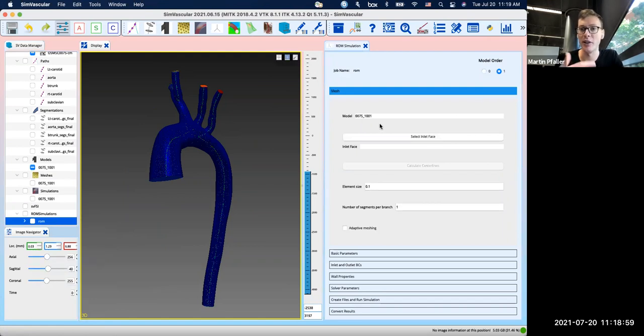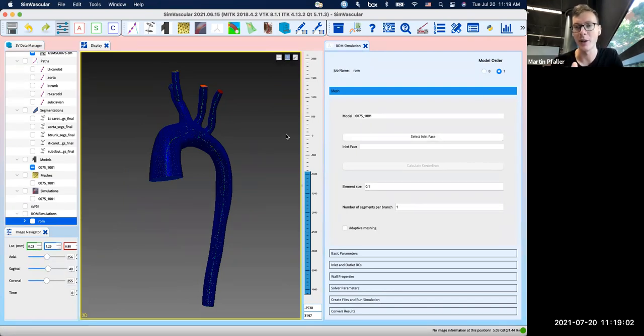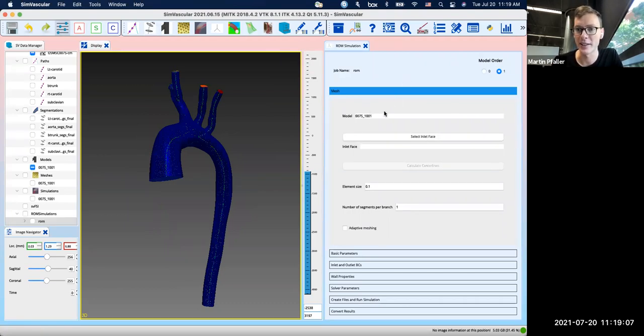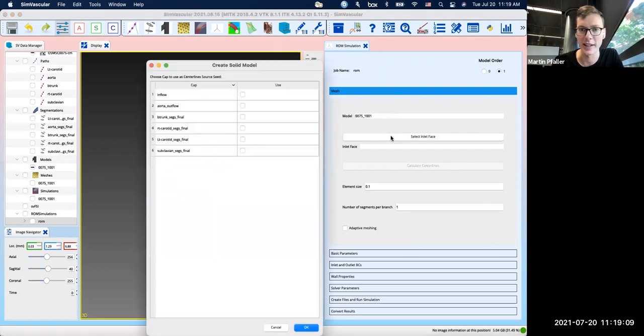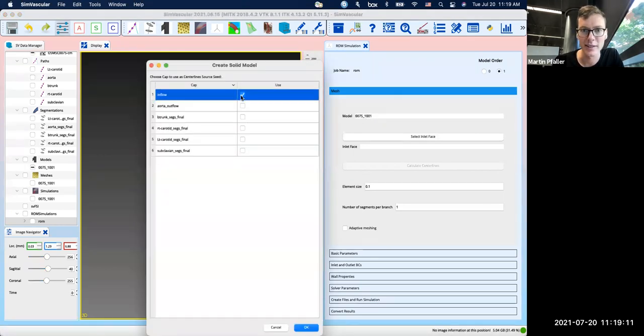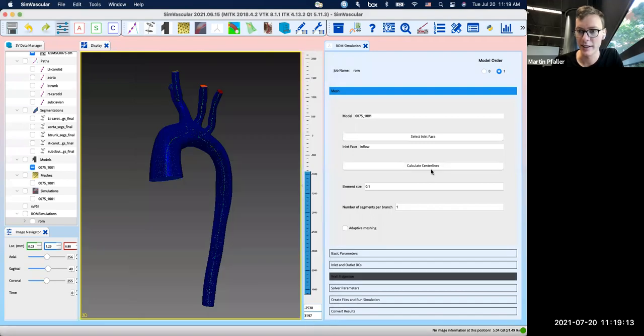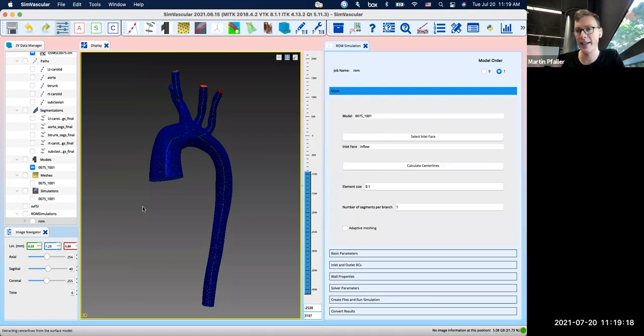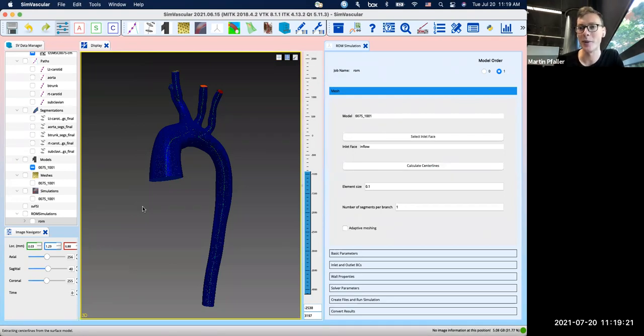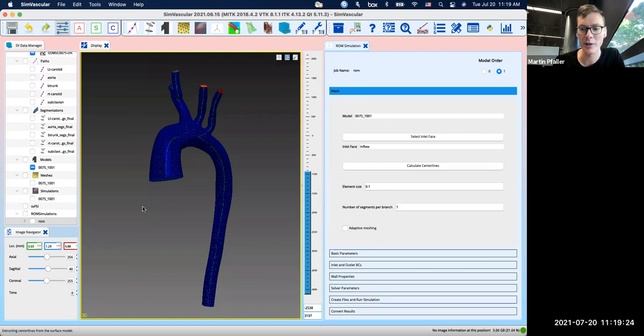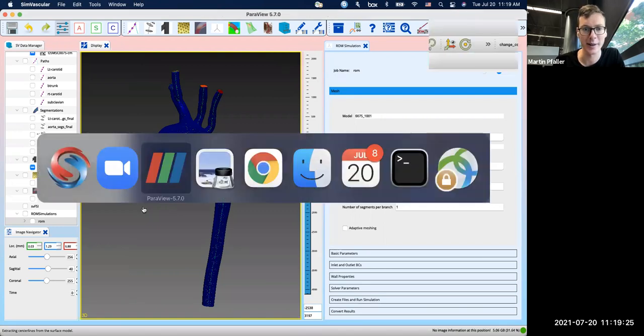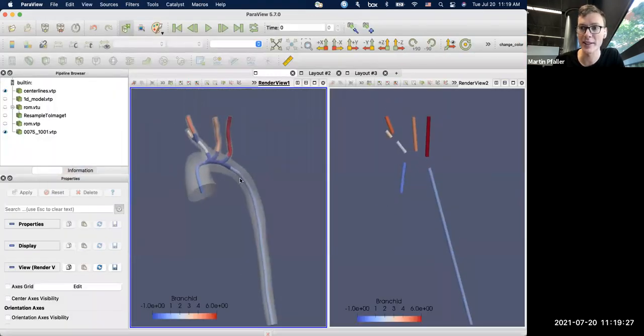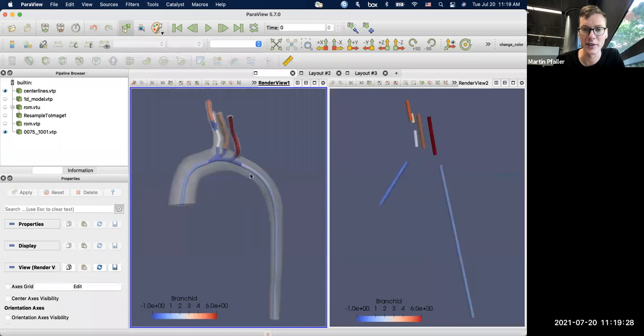And so for every reduced order model, we always start out with a centerline. So the first step is to compute the centerline. I've selected here my 3D mesh, and then I have to select an inlet face. So that's inflow. And then there's just a button that says calculate centerlines. It takes a little bit, depending on how big your model is.